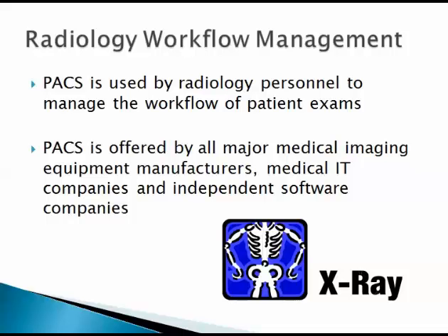Radiology workflow management. A PACS improves the workflow management of a radiology department. PACS is used by radiology personnel to manage the workflow of patient exams. PACS is offered by all major medical imaging equipment manufacturers, medical IT companies, and independent software companies.